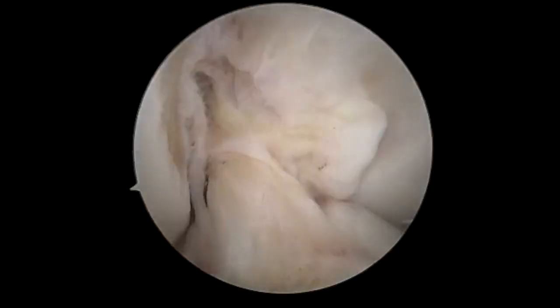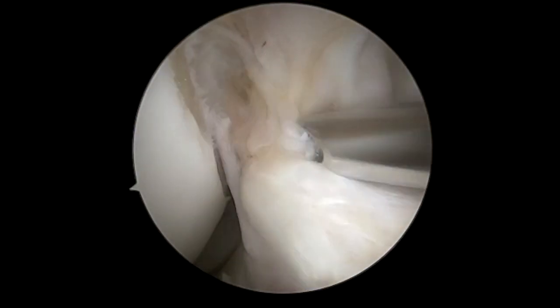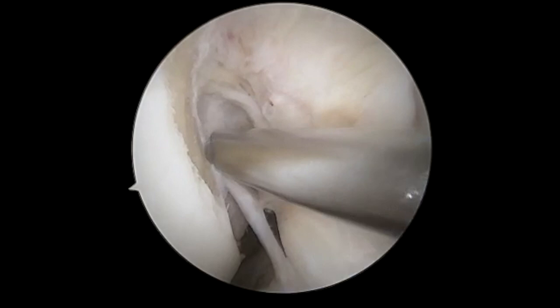We're going to do a notchplasty first. This is the ACL tear — you can see this is a grade two tear. We're going to debride in the figure four position so the ACL is pulled away from the lateral wall.